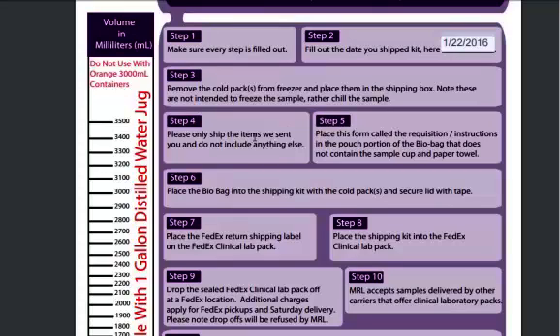But that ice, don't do it, because it'll melt and come out of that bag, and the delivery people will think, oh, that's a biohazard, urine getting all over them. They can end up coming back to the shipper and asking them questions, which is not a great thing.